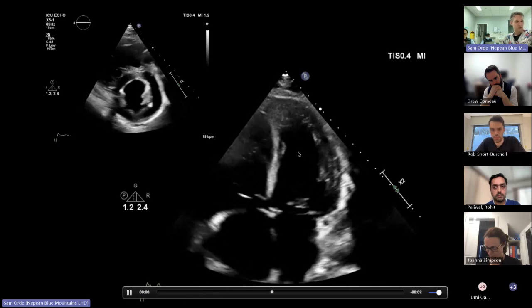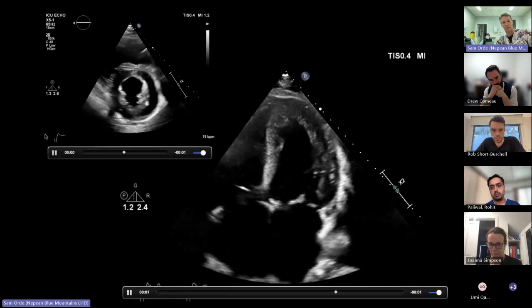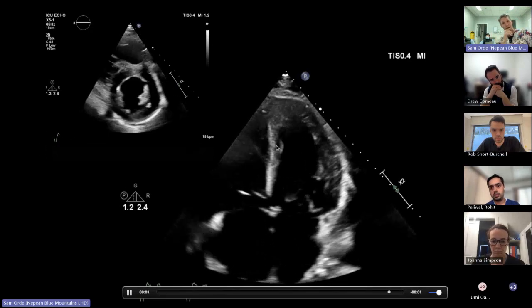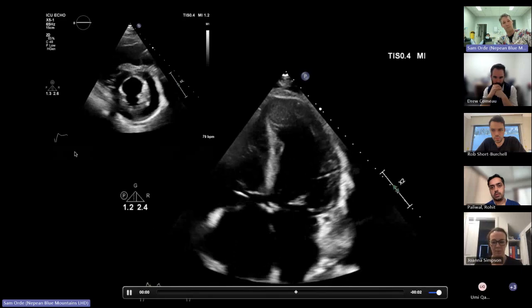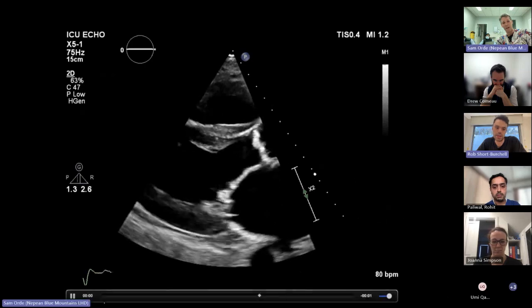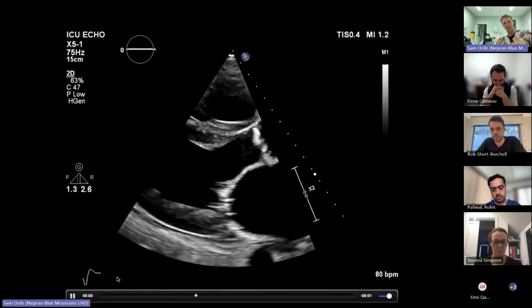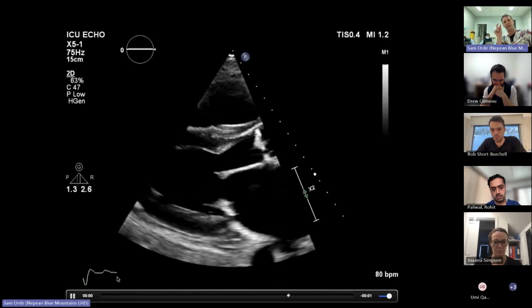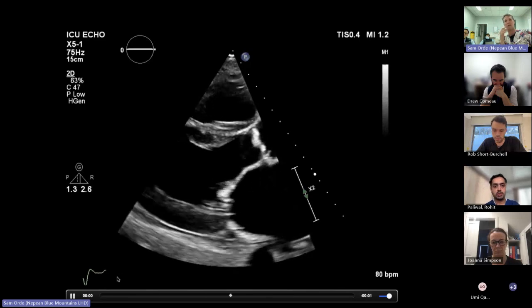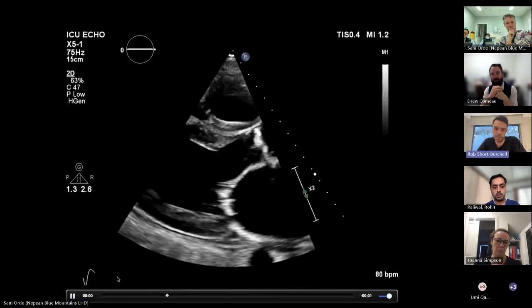The only thing I think which would again have stopped you from getting full marks for me was just mentioning the septum. I think the septum is pushed over a little bit. It's got a bit of a wobble to it that might have been nice to mention, and we've got this interventricular conduction delay. We talk about seeing the whole heart. In this guy with that septal abnormality, you just got to recognize that you can sometimes get some wobbles in what might appear to be regional wall motion abnormalities when you've got that interventricular conduction delay. Yeah.